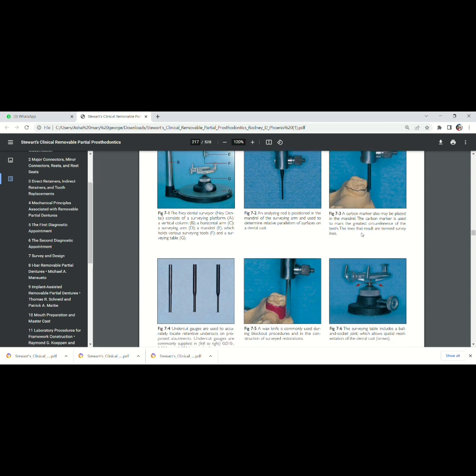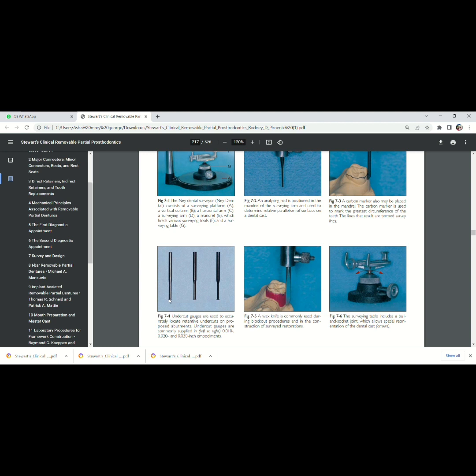Now, how much is the undercut? That can be measured using different types of undercut gauges. Undercut gauges are available as 0.010 to 0.030 inch. This is 0.010 inch. This is 0.020. This is 0.030.